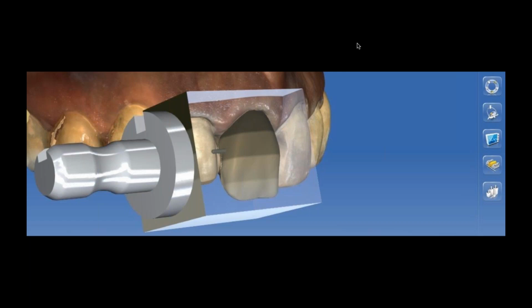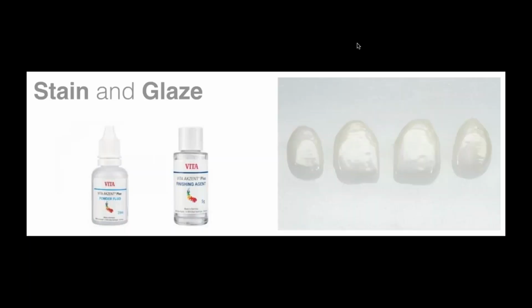This is just a screenshot of the VITA Trilux Forte, and what you can see are those 4 layers of different tones, being much more chromatic or saturated towards the cervical and more translucent towards the incisal. Lately, the tools and the software have improved, so we have more freedom to play with the block and make something very personalized, even though it's a milled restoration.